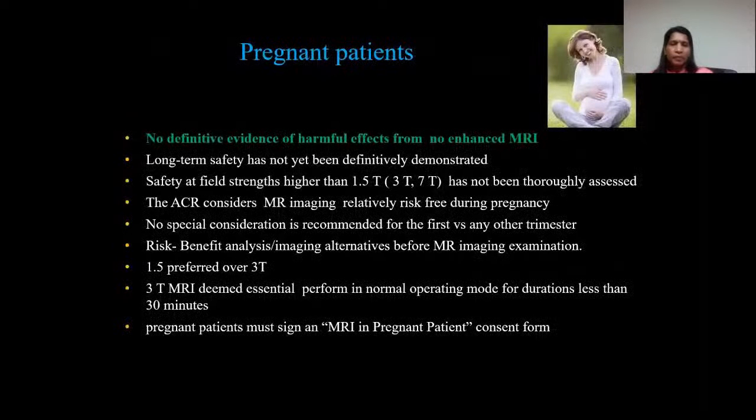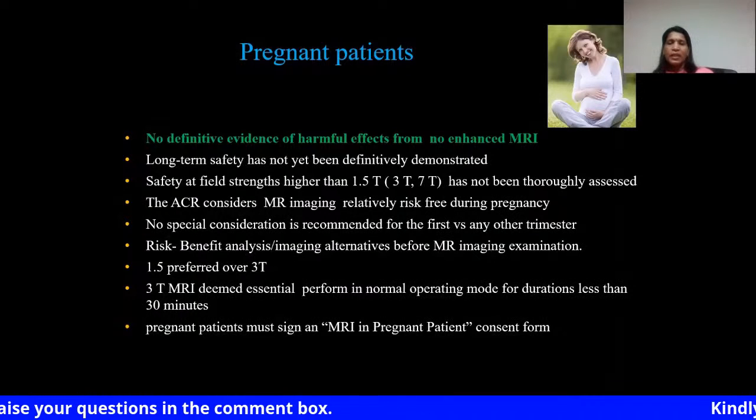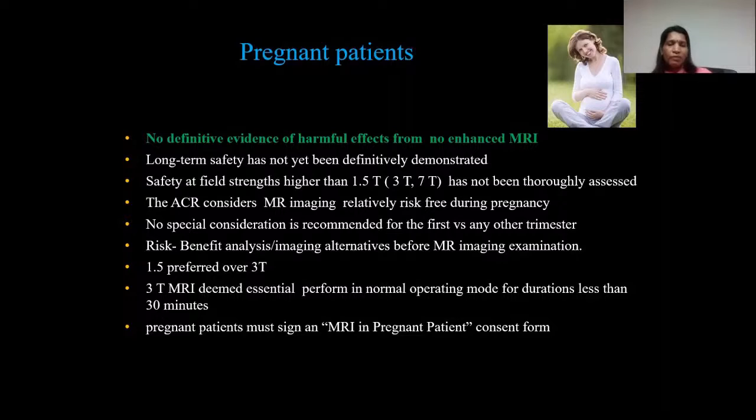Concerning the pregnant patient, when a pregnant patient comes to the department, there is a clinical dilemma whether we can do the MRI or not. Actually, the available data show that there are no harmful effects to the fetus of a mother who has undergone MRI at 1.5 Tesla.